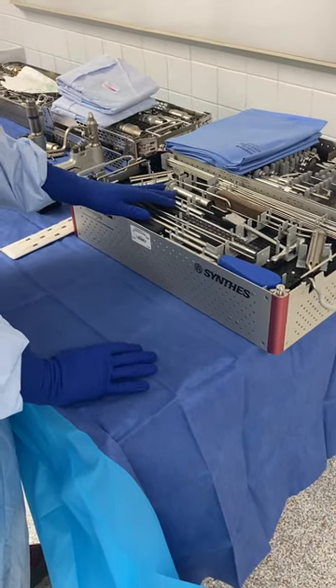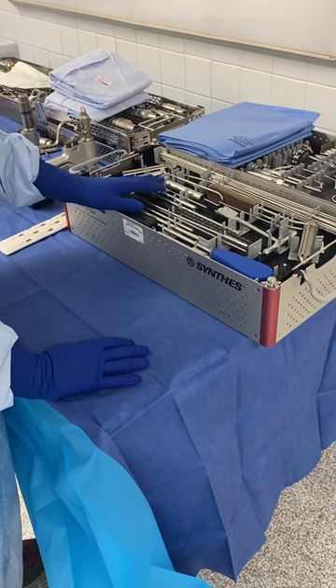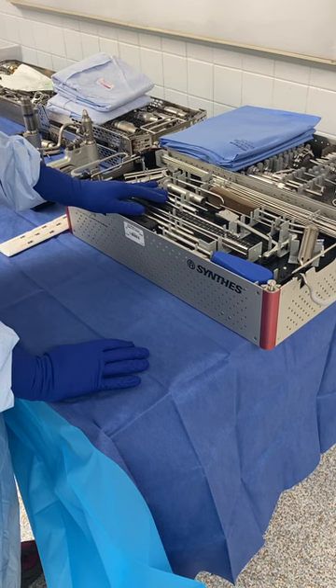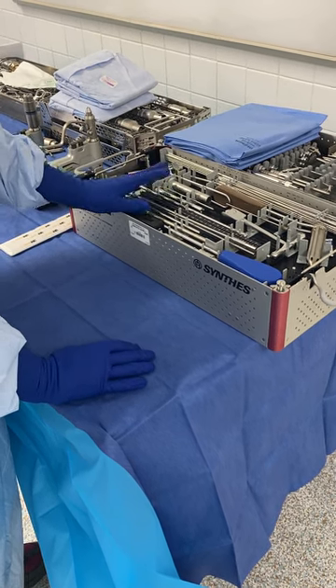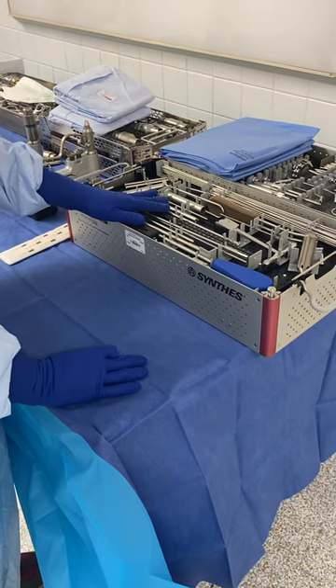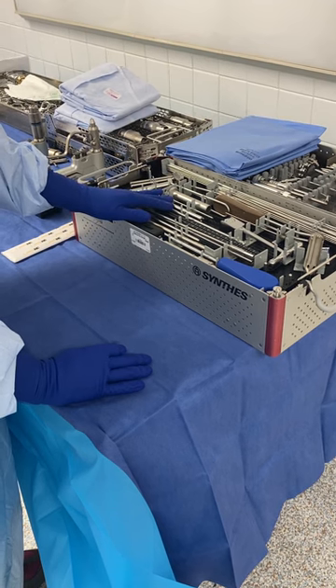Today we're putting in a ramus screw. I have the Synthes 6573 set on the back table. We can use this set for pelvic ramus screws, sacral iliac screws, and they're also very useful when we're doing pinning of a proximal femur. They'll even use them on an olecranon sometimes.